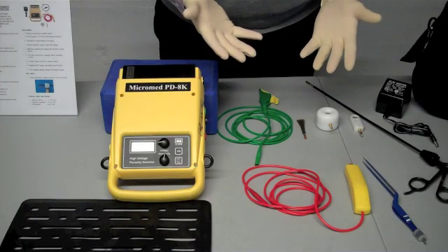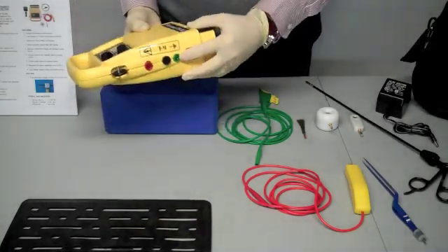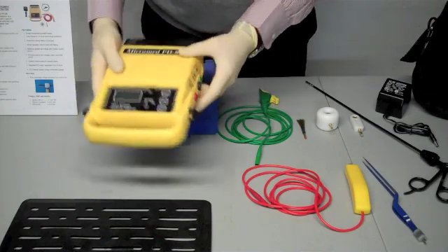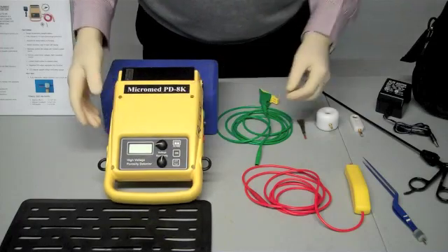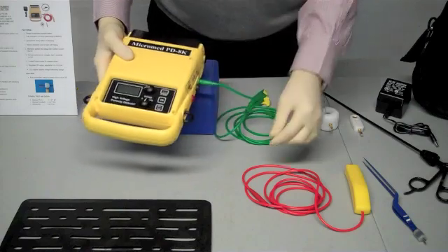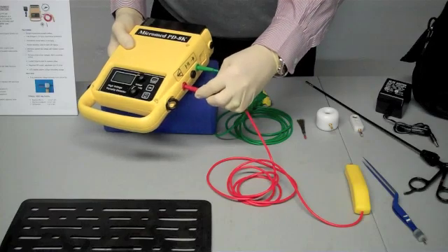Make sure you put surgical gloves on to protect yourself during testing. On the side of the unit we have a green port and a red port. We'll now insert the green ground wire into the green port, the red high voltage wire into the red port.